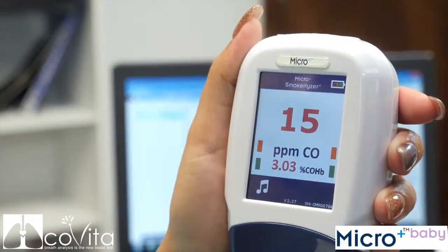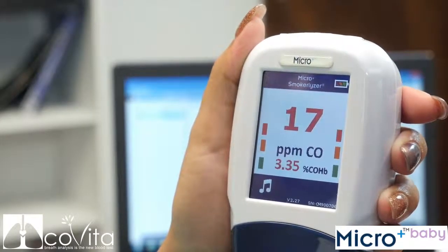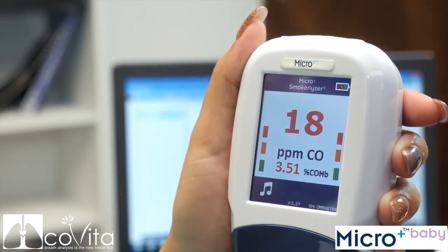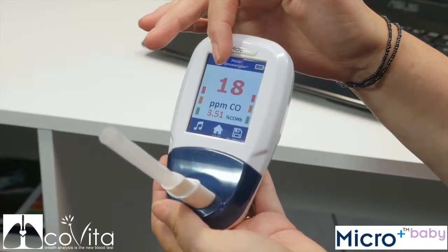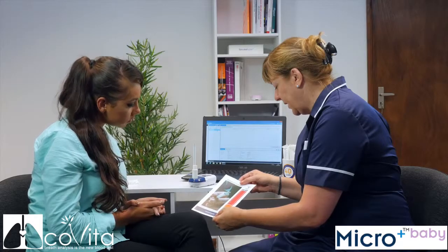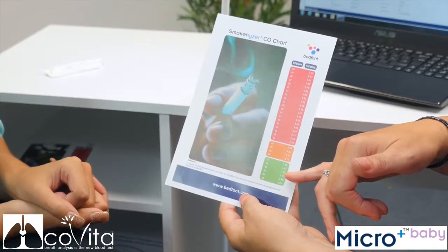The reading will rise and stabilize on screen, and you can choose to mute the monitor if necessary. When the test is finished, you can save the reading to a patient's profile or return to the home screen. Readings and results can be interpreted with the Smokerlyzer CO chart.